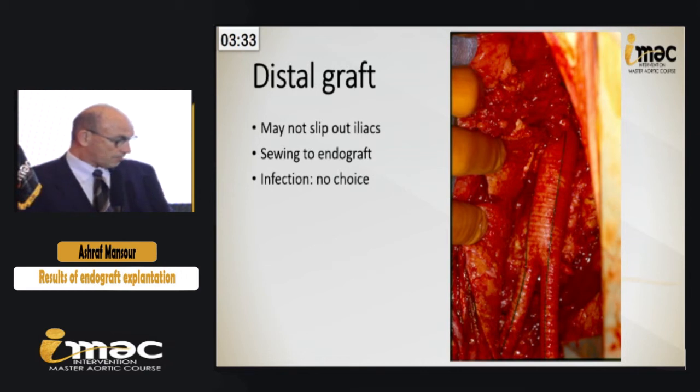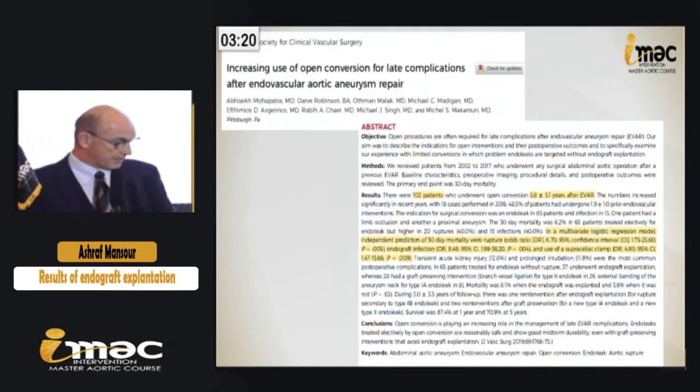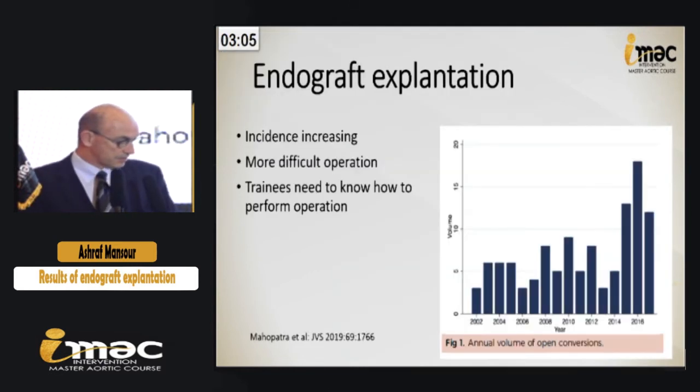The issue that you will always encounter during the operation is, should you leave any graft behind and sew your new Dacron graft to some portion of the old stent graft? This is a paper that Dr. Macroon mentioned, and I think this is the most up-to-date reference in the literature that discusses open conversion after endografts. And I want to summarize a couple of points here.